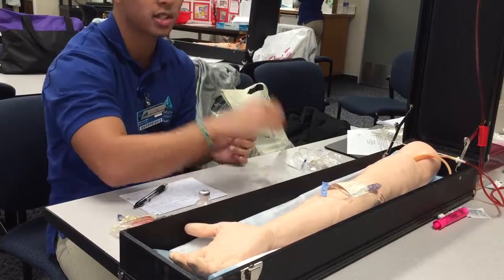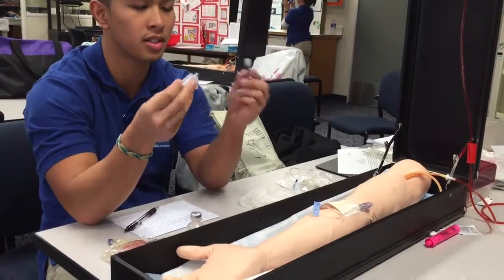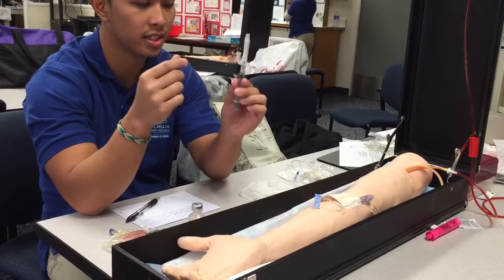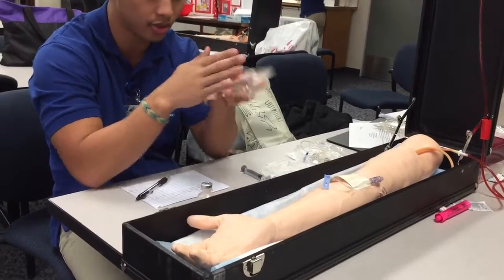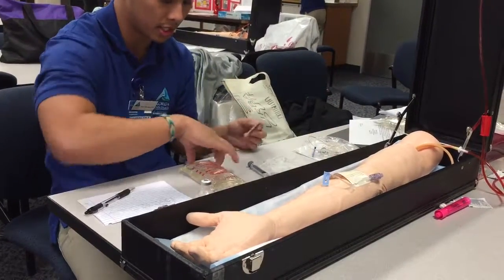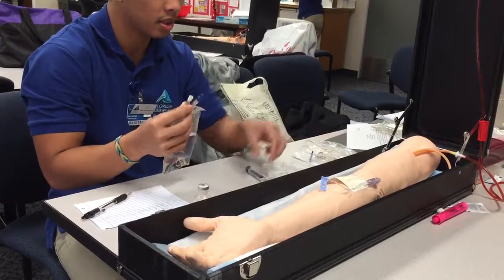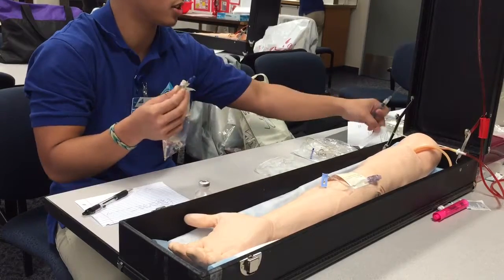This is a brand new needle, so we're going to banana peel that right there. This is sterile, this is sterile. I'm going to put that on there. So this is ready to go. This right here is the mini bag that we're going to use, and once again I'm going to use an alcohol swab to cleanse the site right here and clean that off. I'm going to dispose of that. So now I can take this off, excuse me, and throw that away.